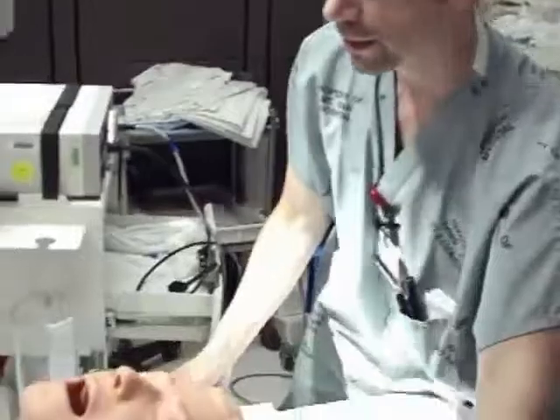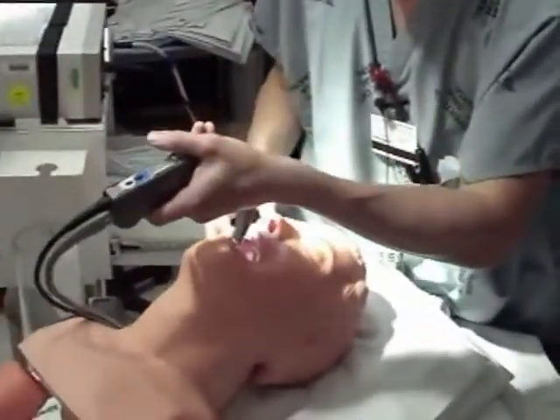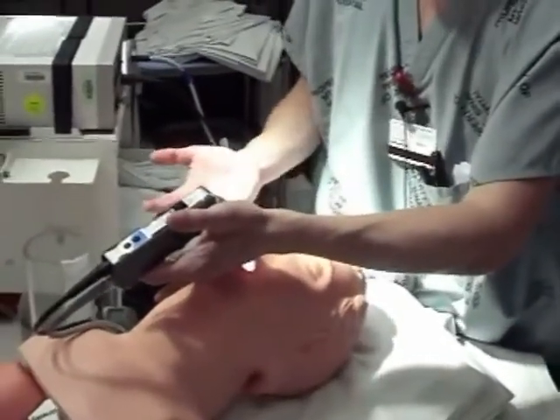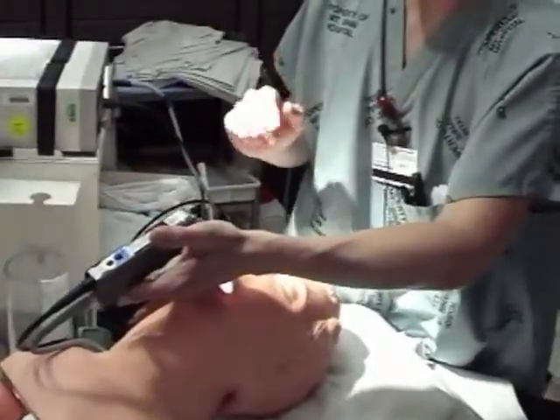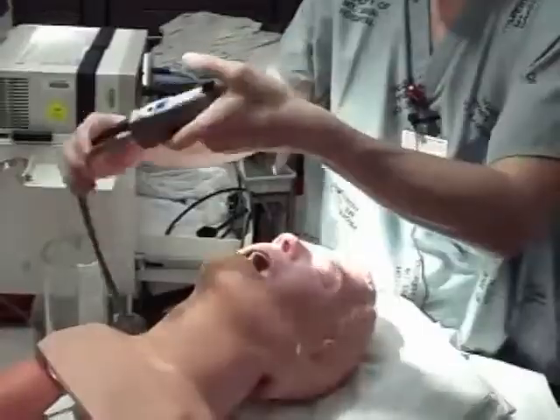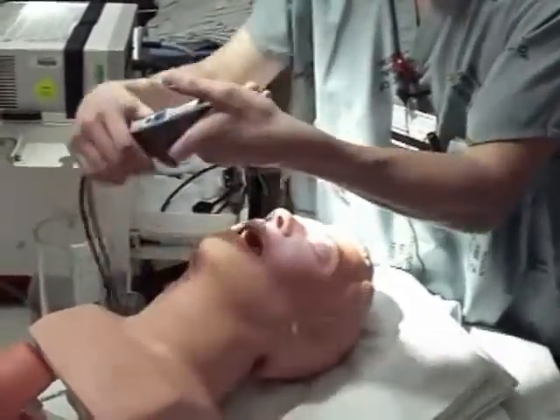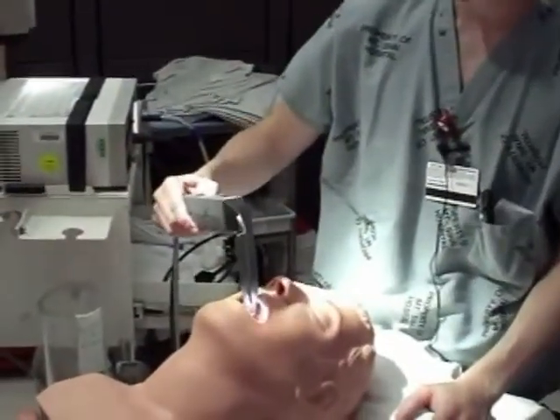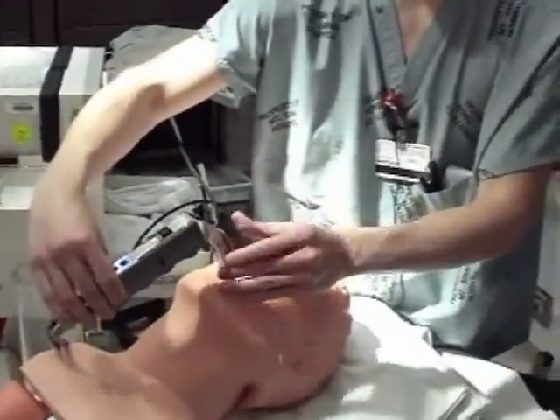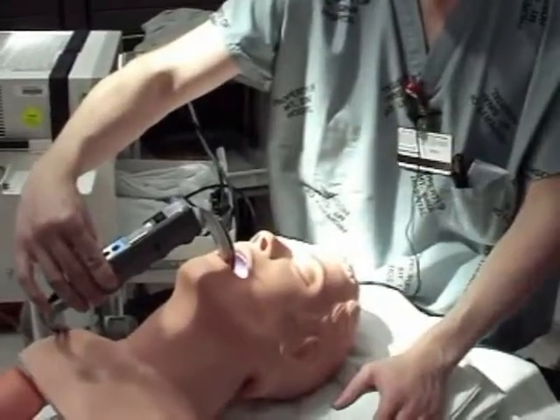Your next cognitive step is to grab your laryngoscope and put it in the mouth. On this mannequin it's easy to put one inch of blade in the mouth. But some folks — because they'll have a big chest or they're pregnant — won't be able to get the blade in the mouth directly. In that case, just drop it in one inch horizontally and then turn. You've accomplished the next step when you have one inch of blade in the mouth.